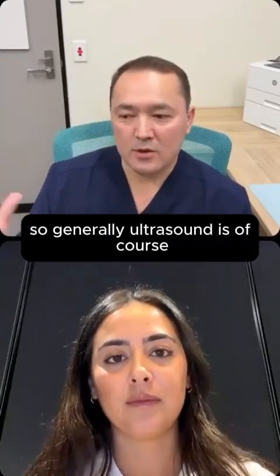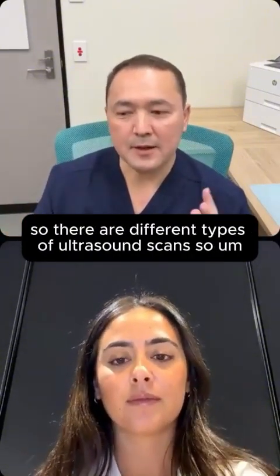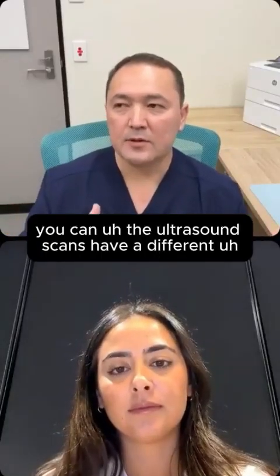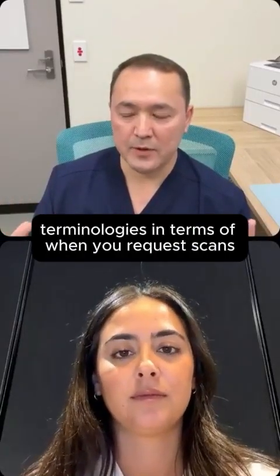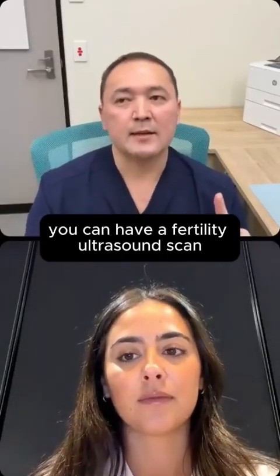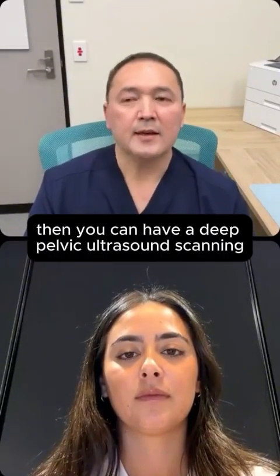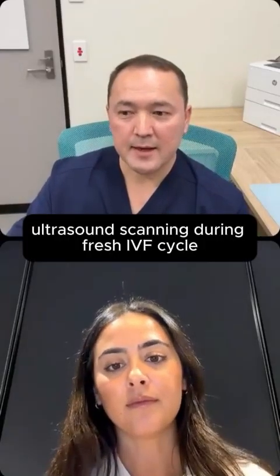Generally, ultrasound is, of course, one of the main tools we use in IVF. There are different types of ultrasound scans, with different terminologies depending on what you request. You can have a simple gynecological ultrasound scan, a fertility ultrasound scan, a deep pelvic ultrasound scan, or IVF monitoring ultrasound scanning during a fresh IVF cycle.